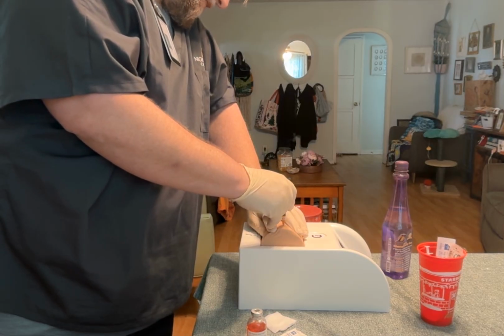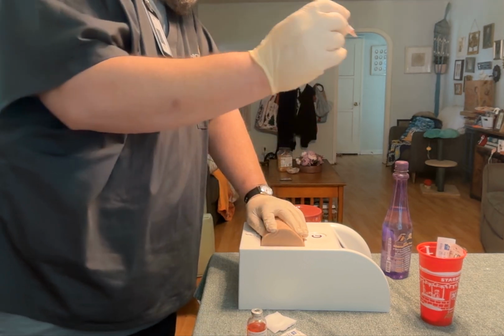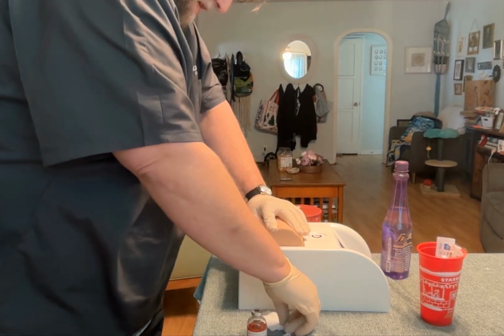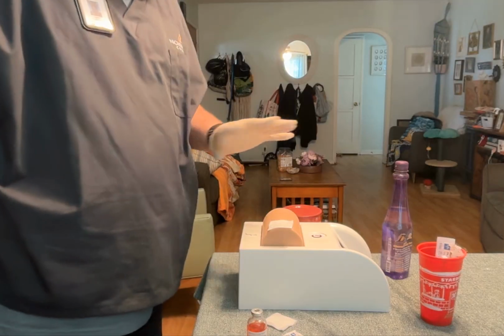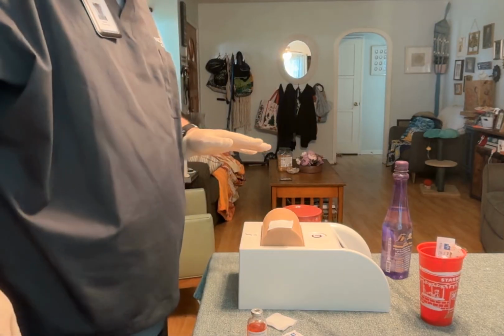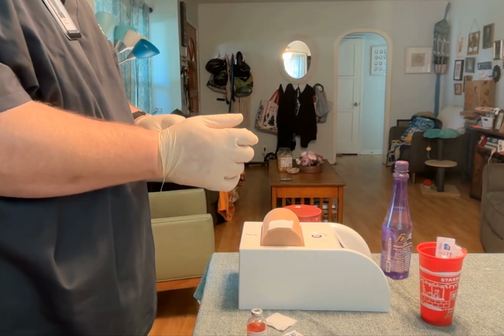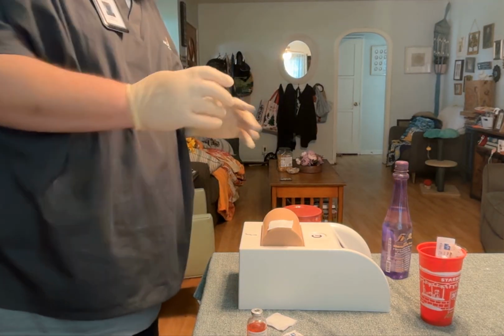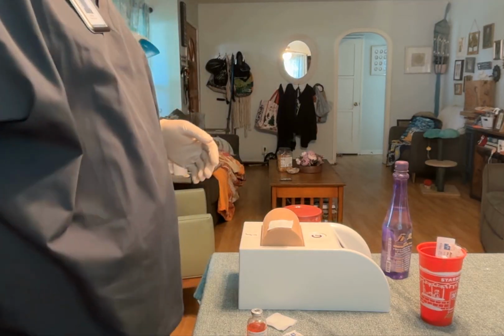I'm going to hold this for another 10 seconds. Take my needle, put it in my sharps container. I'm going to take my gauze pad. I'm just going to lay it down. Not massage, not do anything else to the site. Site looks good. And there's no bleeding at the site. It's normal. I don't have to do any cleanup. I would put a Band-Aid on if there was bleeding and clean it with alcohol.